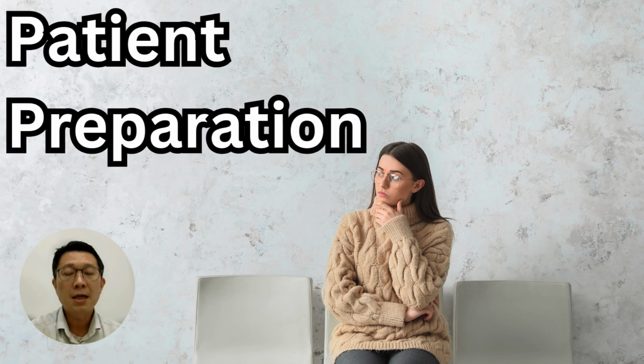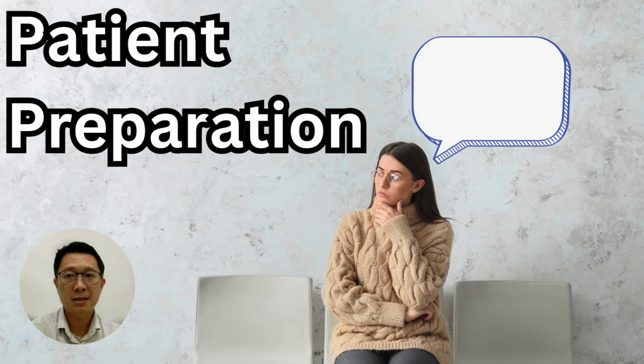Let's talk about the patient preparation. Before conducting the visual field test, it's important to make sure the patient is fully prepared and comfortable. Begin by explaining the purpose of the test in clear and simple terms, so the patient understands what will happen. Adjust the sitting position, chin rest, and forehead rest to suit their height and posture, ensuring a stable and relaxed position. Confirm that the patient feels at ease and is ready to proceed, as comfort and proper position are essential for maintaining focus and achieving accurate test results.